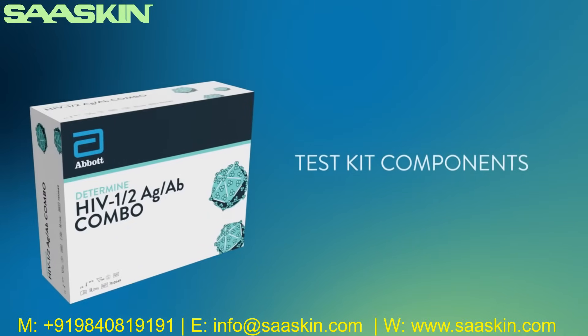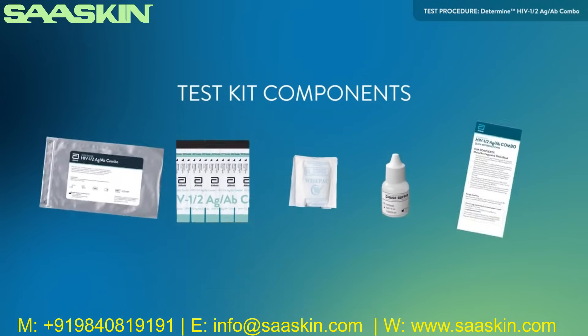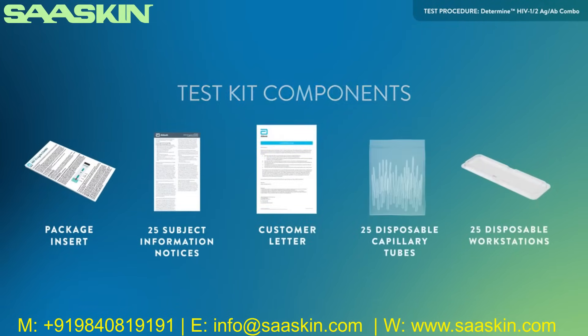Each Determine HIV-1-2 Antigen-Antibody Combo Kit contains one aluminum Ziploc pouch containing five test cards with 25 test units, a desiccant package, chase buffer, quick reference guide, package insert, subject information notices, customer letter, disposable capillary tubes for collection and transfer of finger stick samples, and disposable workstations.